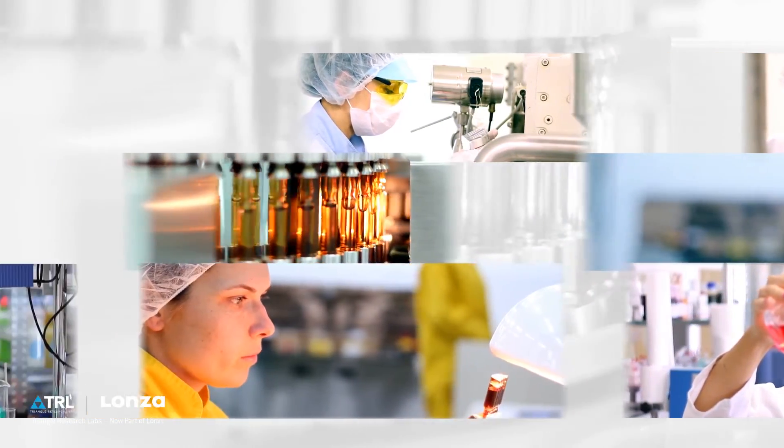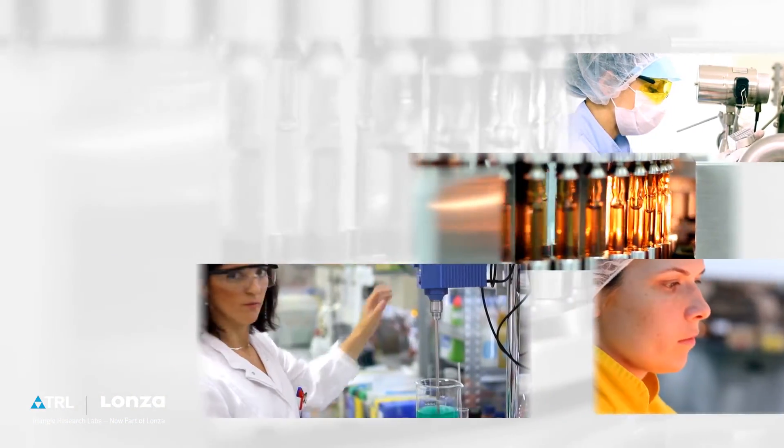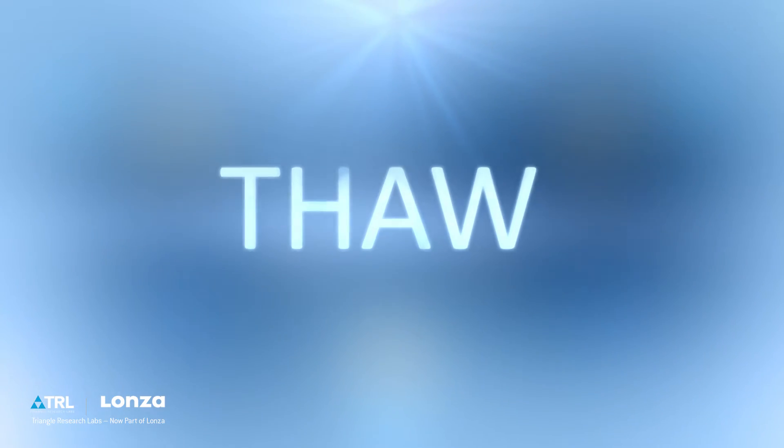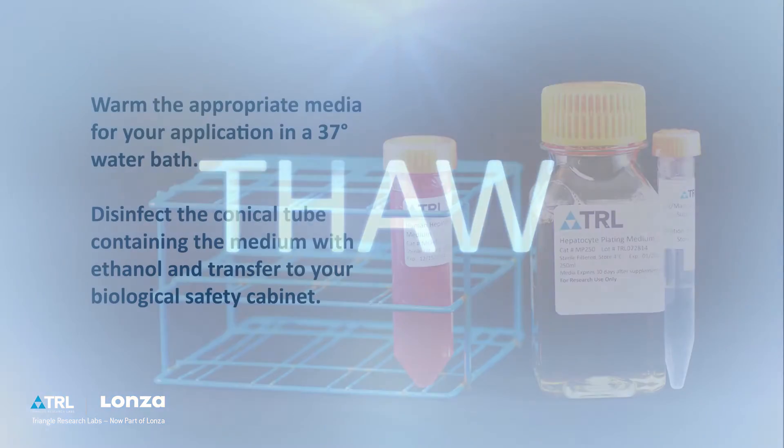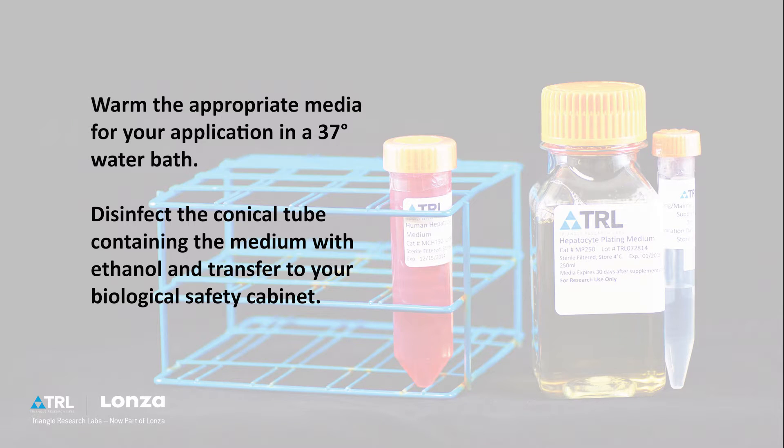Also, be sure to prepare your biological safety cabinet for thawing and plating. Let's get started. Thaw. Warm the appropriate media for your application in a 37 degrees Celsius water bath. Once warm, disinfect the conical tube containing the medium with ethanol and transfer to your biological safety cabinet.